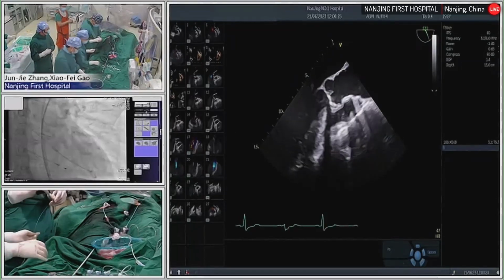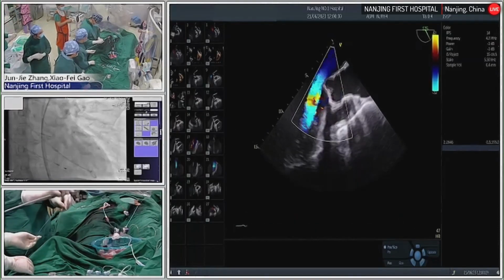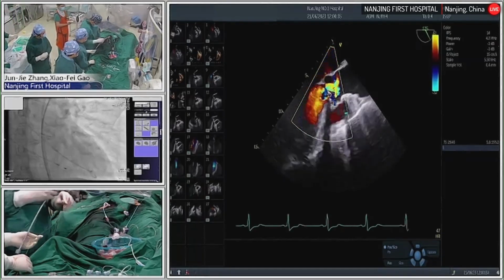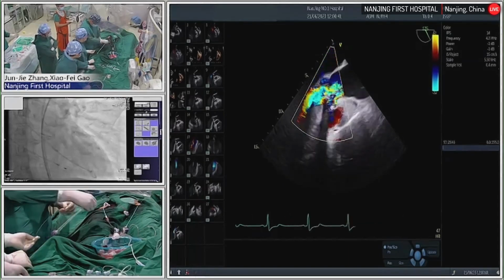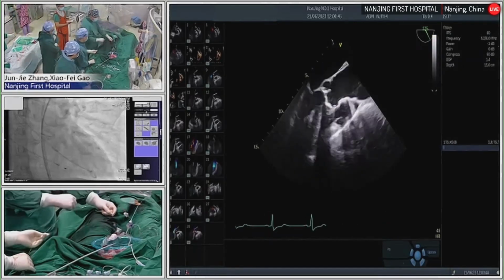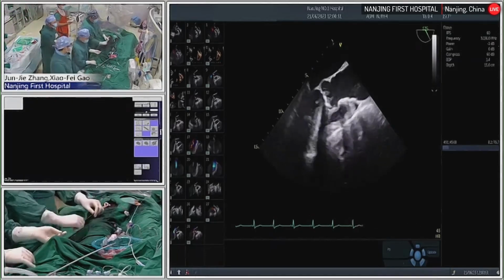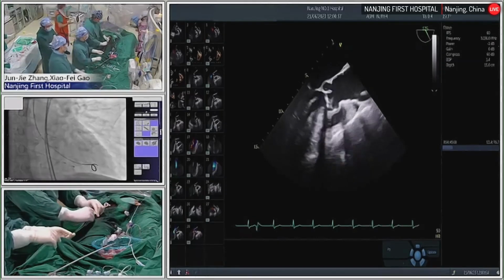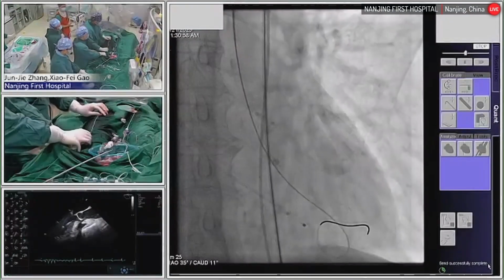The regurgitation is not very much, Professor. Okay. A little bit. Okay. There is no severe regurgitation. Yes. Okay, it's good. Yes, okay. The hemodynamic is stable. We have enough time. Yeah, and also you can see after BAV, the gradient was decreased. Speed up the fluids. Okay, good.